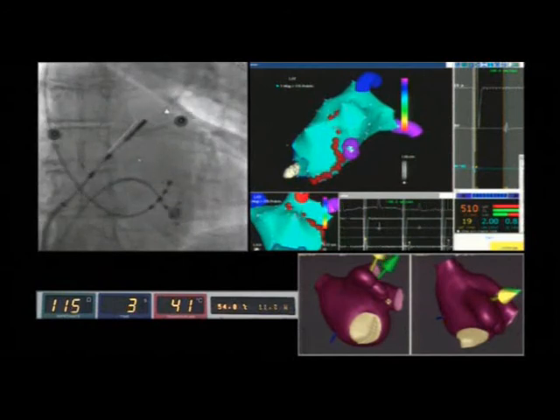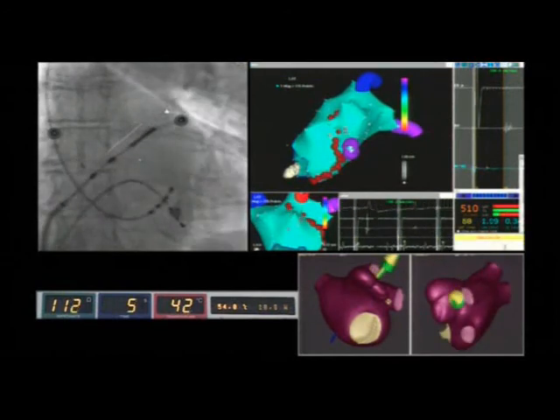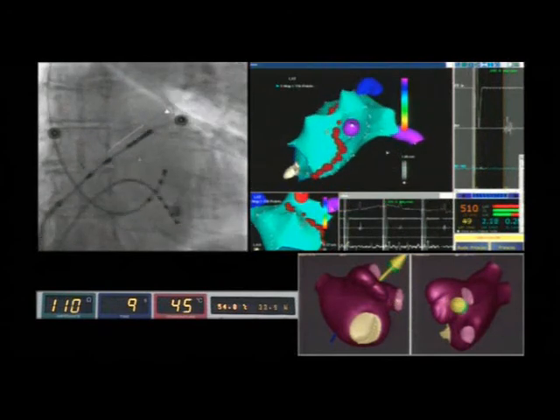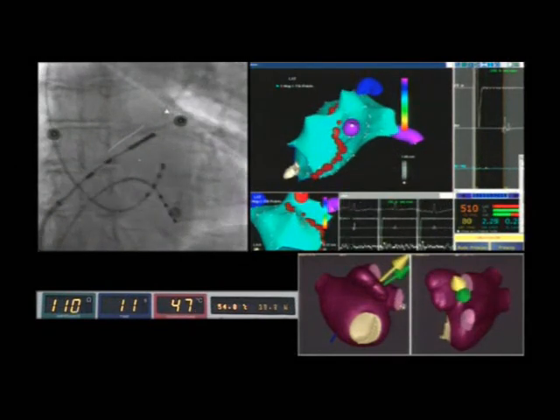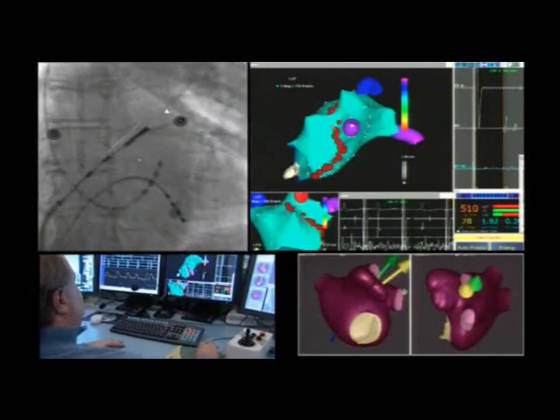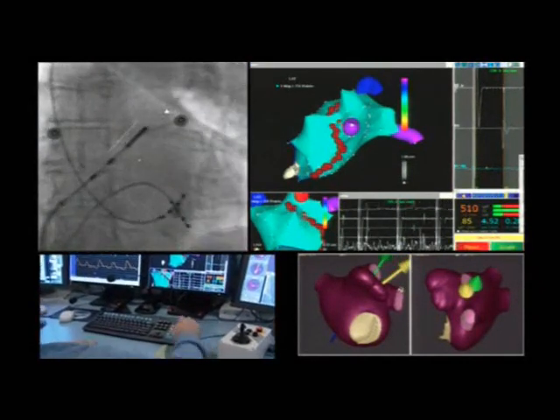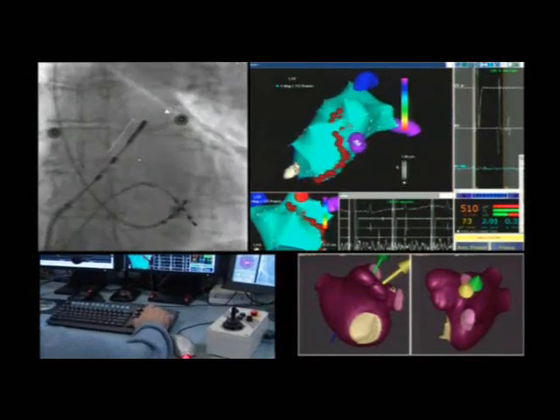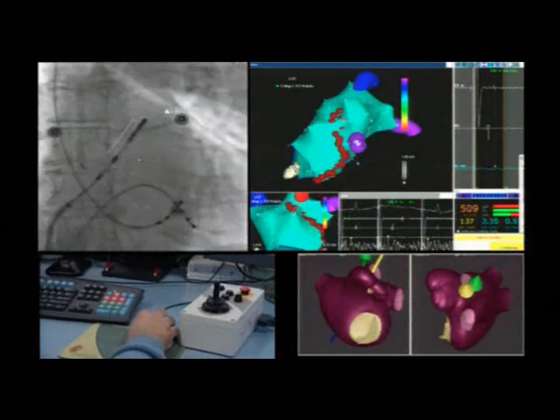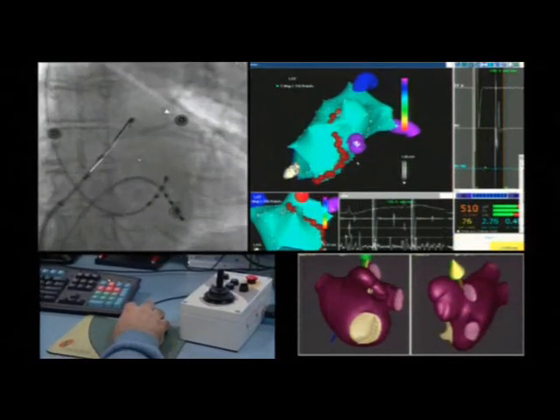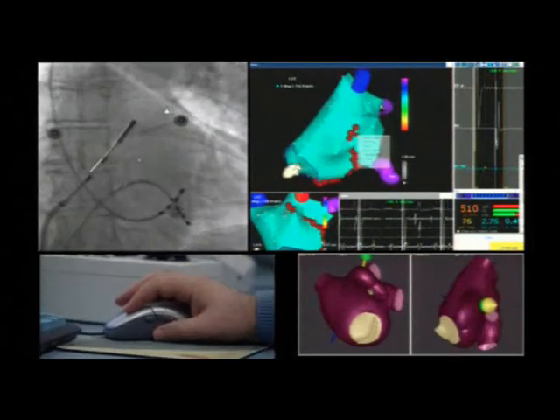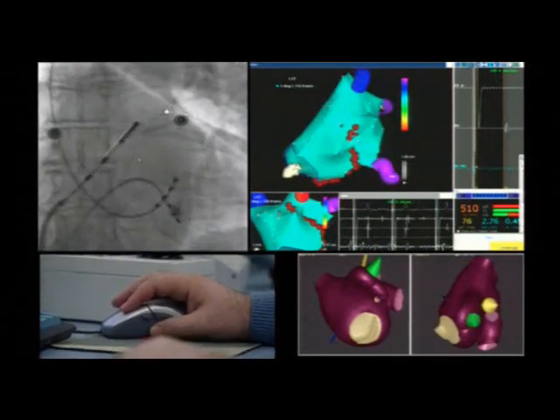The stability of the catheter can be checked on the fluoroscopy, where we can also see minimal movements of the catheter induced by the operator. The procedure is followed simultaneously on the CARTO, where by constant rotation it is possible to apply contiguous ablations even in challenging points.